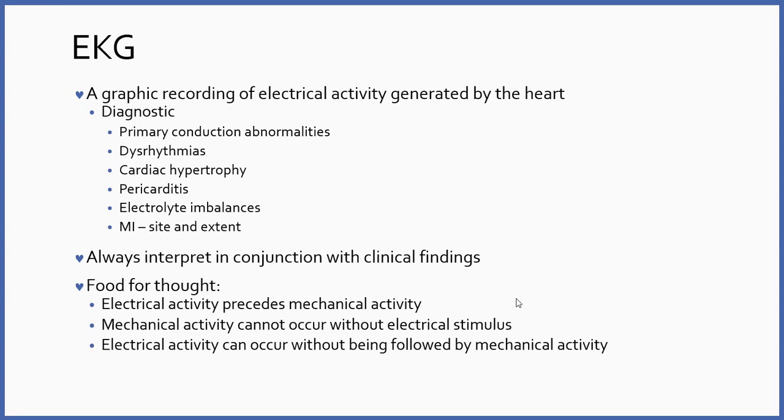So what is an EKG or ECG, electrocardiogram? It's a graphic recording of electrical activity that's generated by the heart. A guy named Einthoven figured out how to do this way back in the early 1900s. It was like 1901. EKG is a really helpful assessment tool.